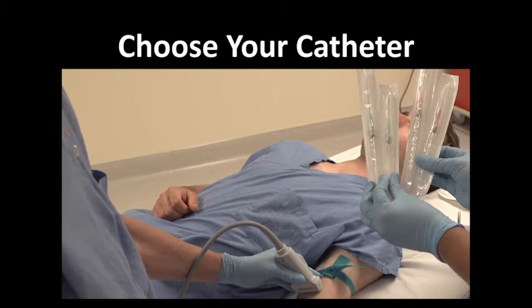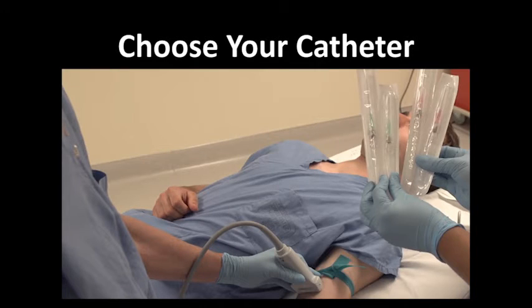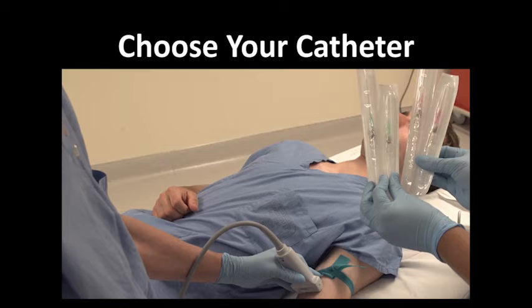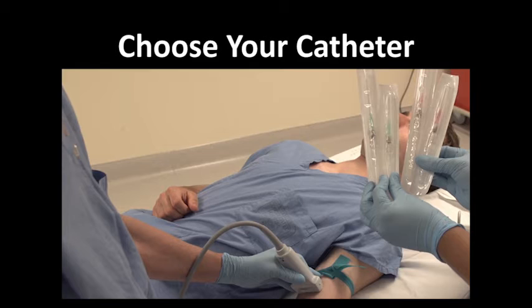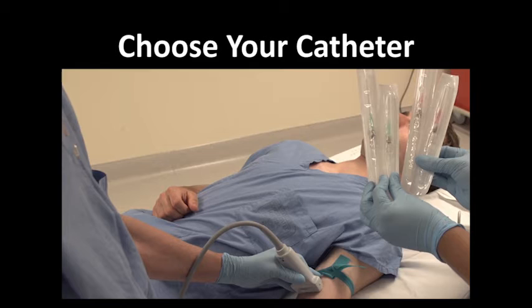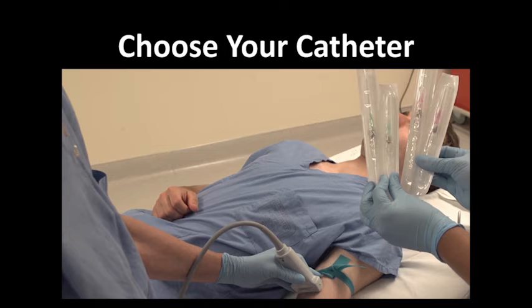Use the depth button to adjust the depth such that the vessel of interest is in the lower portion of the screen, then use the calipers on the side of the screen to check how deep your vessel of interest is. Depending on the depth of your vessel, use an appropriate length catheter of the desired caliber. For vessels one centimeter or greater in depth, we strongly recommend use of a longer than standard catheter to avoid the catheter falling out.